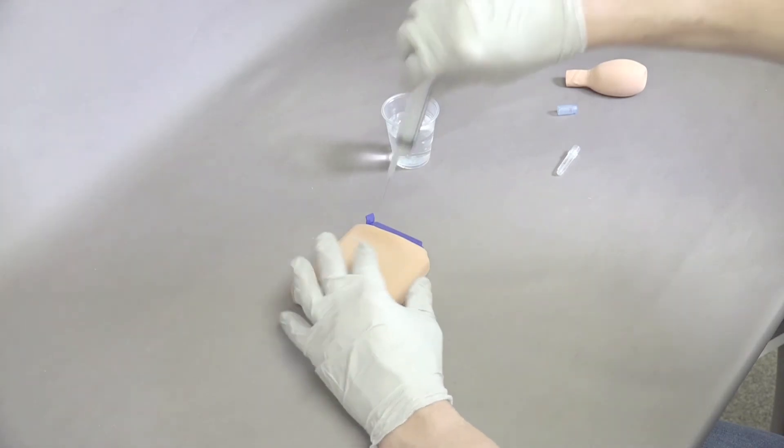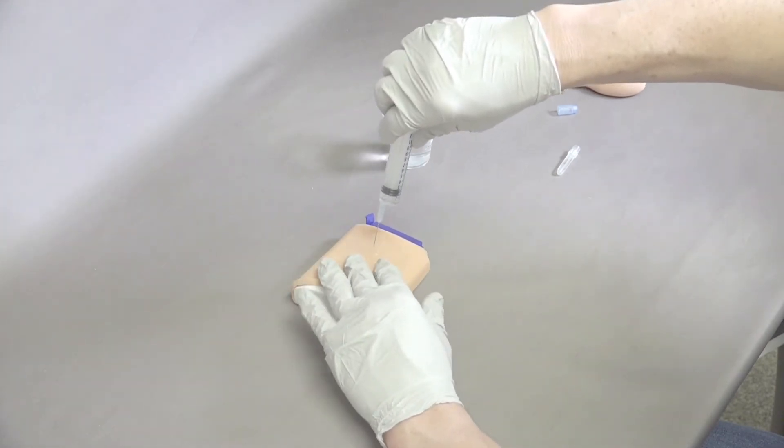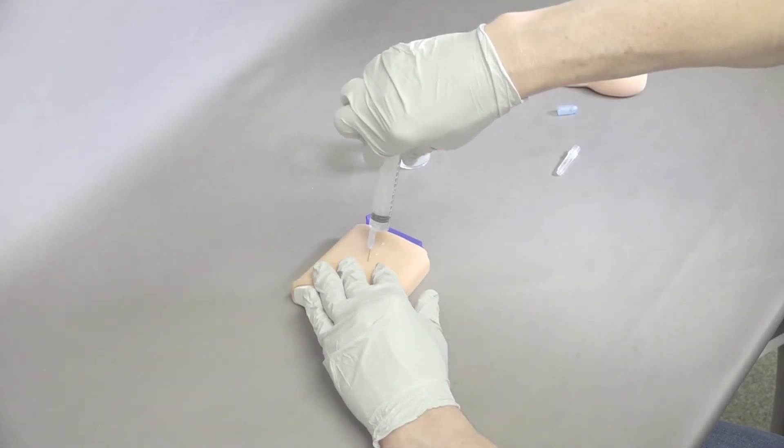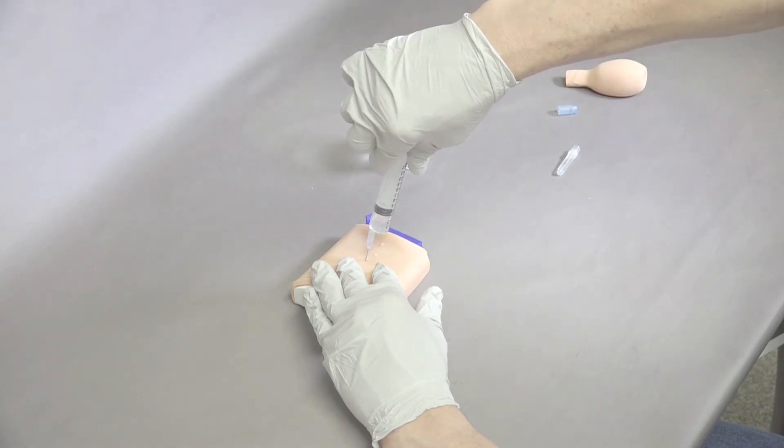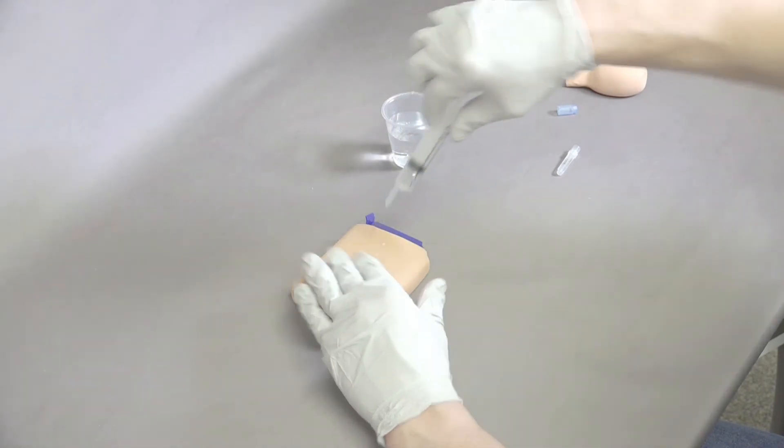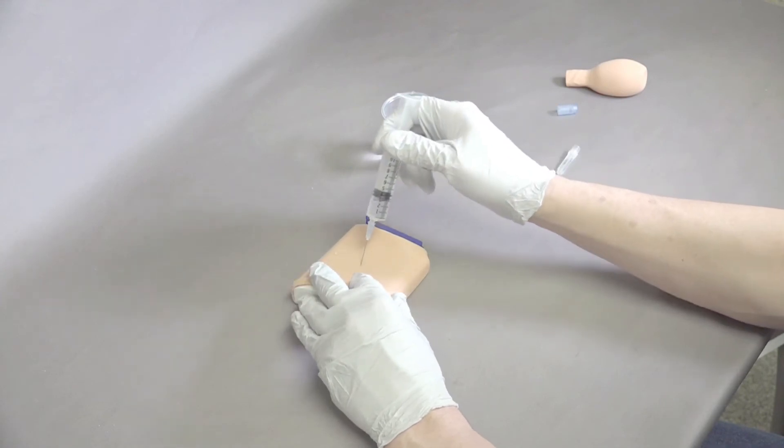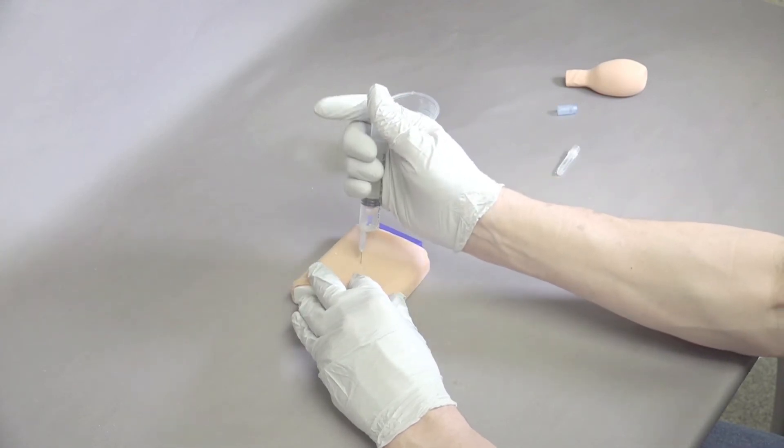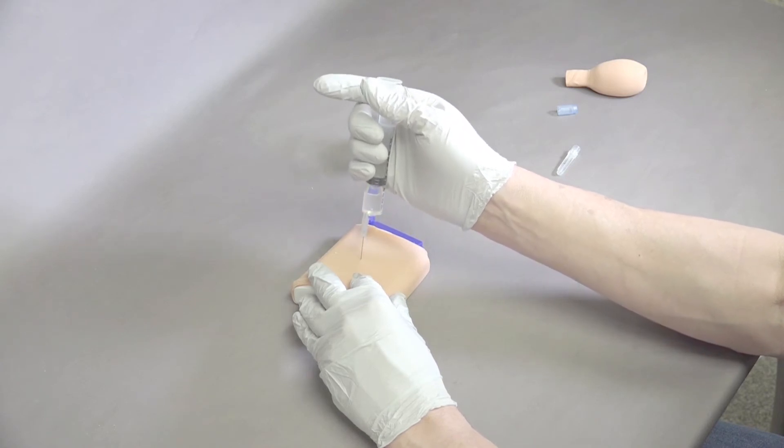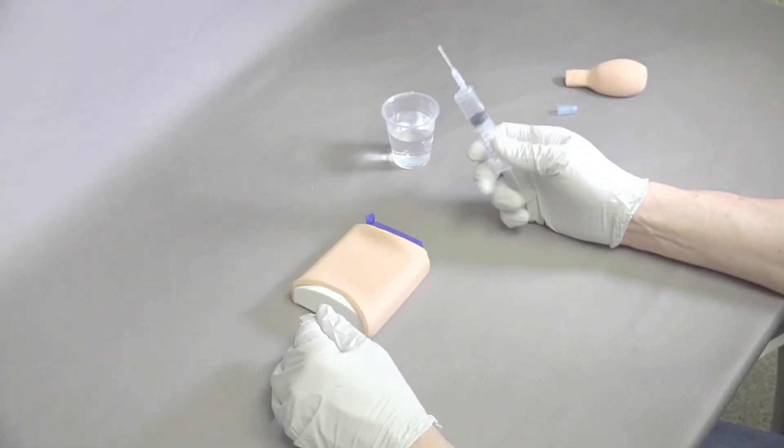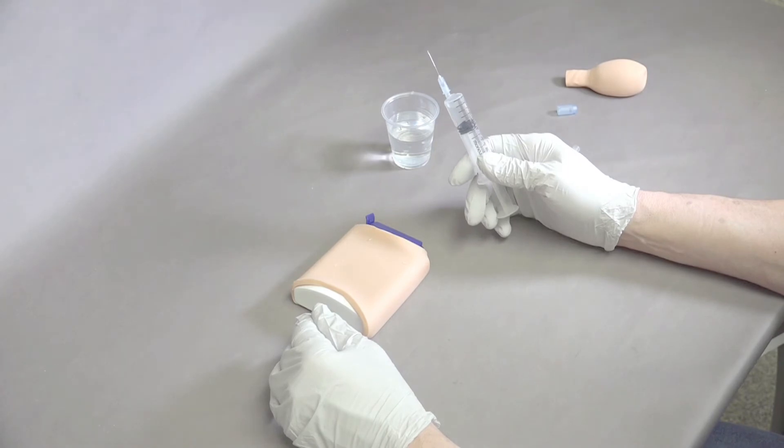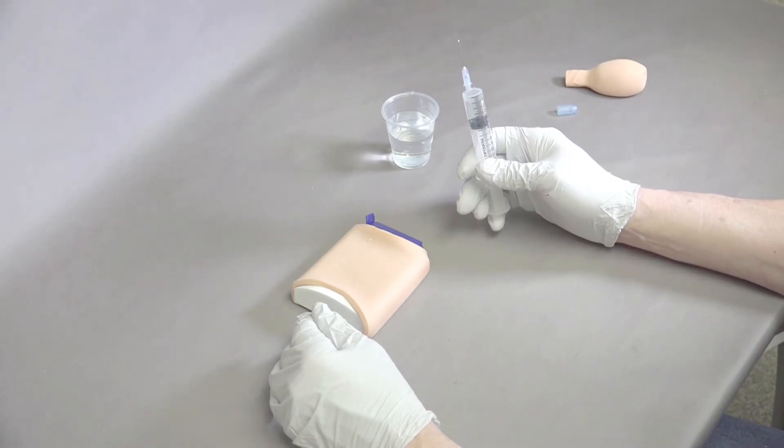The nice part about this model is that we can palpate, identify where it is, and pull more urine out. Palpate, come in, and pull more urine out until we've removed probably the first 12 ml. There needs to be at least 12 ml of fluid in here to be effective, otherwise it flattens out.